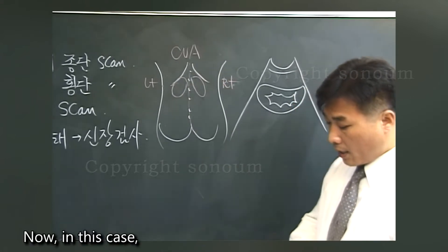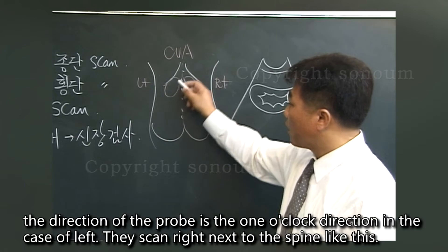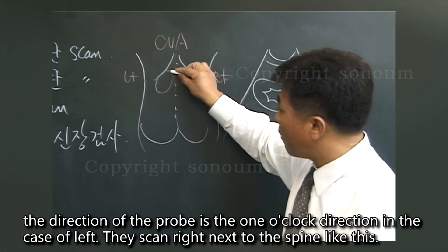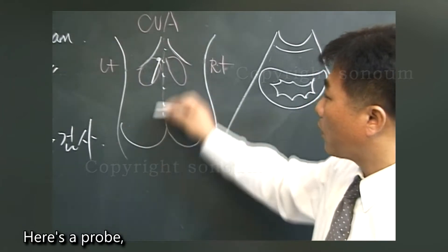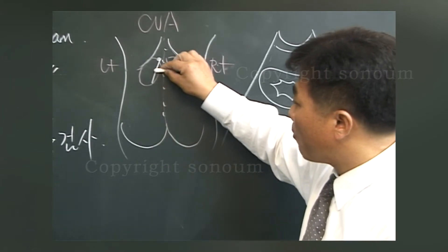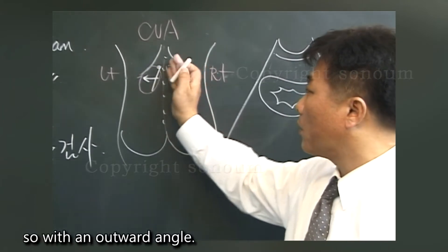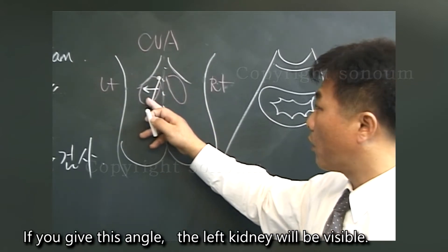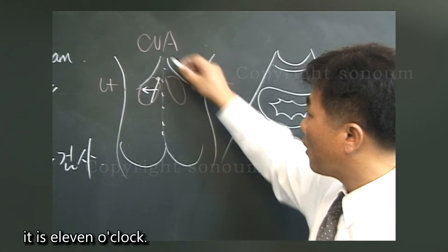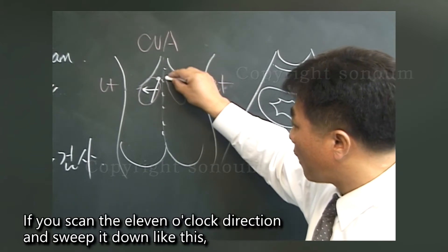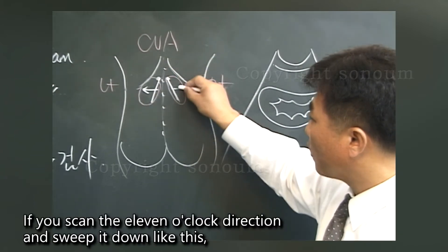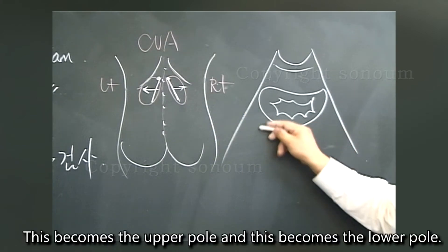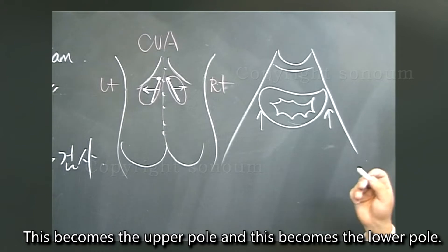In this case, the direction of the probe is the 1 o'clock direction for the left kidney. Scan right next to the spine with an outward angle. If you give this angle, the left kidney will be visible. For the right kidney, it is the 11 o'clock direction. If you scan in the 11 o'clock direction and sweep it down, the kidneys will be drawn. This becomes the upper pole and this becomes the lower pole.